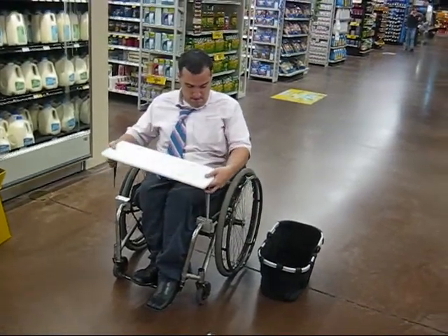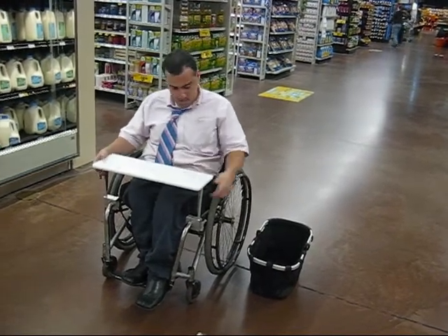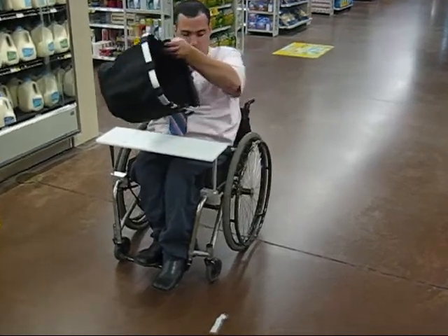The client begins assembling the wheelchair shopping aid by inserting the vertical support rods into the holes in the frame clamps. These rods support the basket tray, which the basket can then be placed onto so that the user is ready to shop.